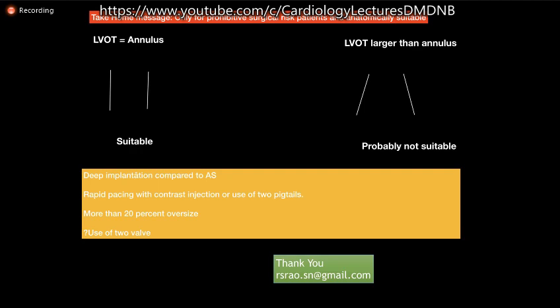But if the LVOT is larger than the annulus and the patient has pure AR, there is no calcification in the LVOT and the annulus, and the ascending aorta is dilated, probably TAVR should not be attempted with the current generation valve unless a dedicated TAVI valve is available, because in such a patient, there's a high possibility that you might convert an elective high-risk case to an emergency high-risk case.